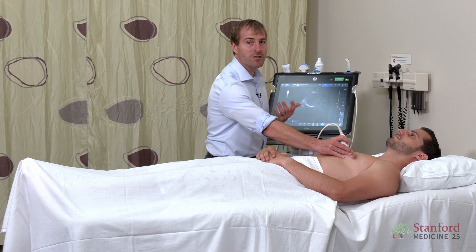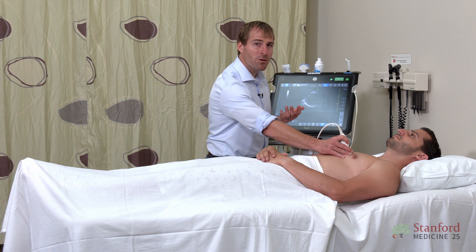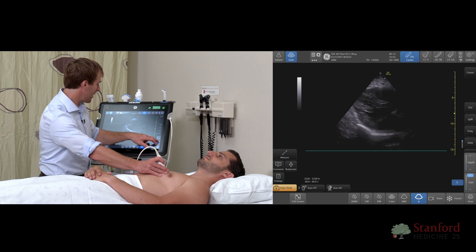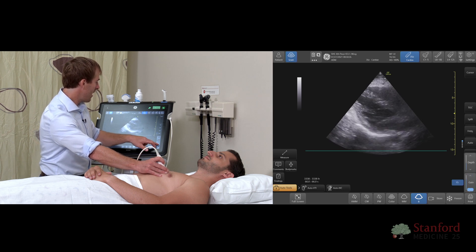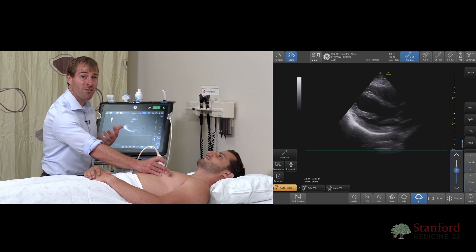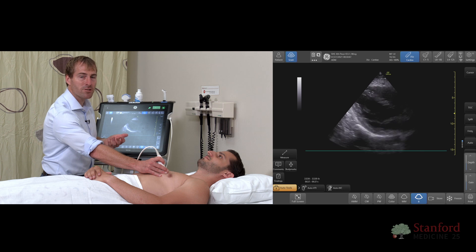Gain is another function you may find yourself needing. To be honest with you, most of the modern machines have great presets. I'm in cardiac mode right now — I'm taking pictures of the heart — and I usually don't need to adjust gain very much. But if I did, this adjusts the sort of brightness of the image. I can dial it way up and everything gets brighter, or I can dial it down and everything gets darker. For most scanning these days, the presets are good enough and you don't need to change the gain very much.